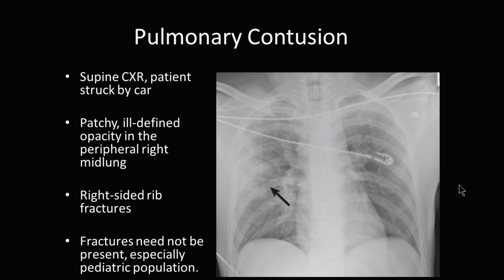Pulmonary contusion. This individual had a supine chest x-ray. The patient was struck by a car. If you look here, you see this patchy, ill-defined opacity in the peripheral right mid-lung. Additionally, there are some fractures within these ribs. This is a pulmonary contusion.